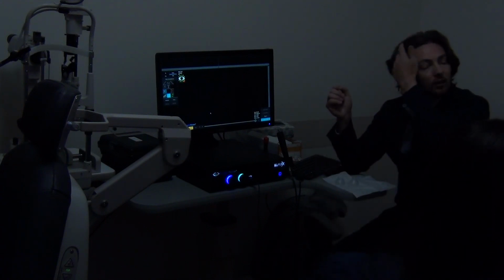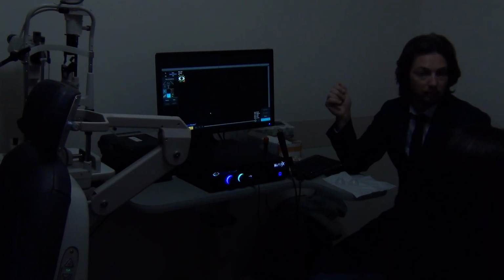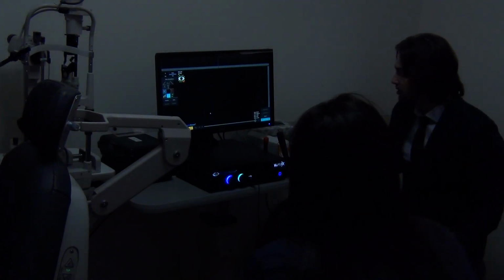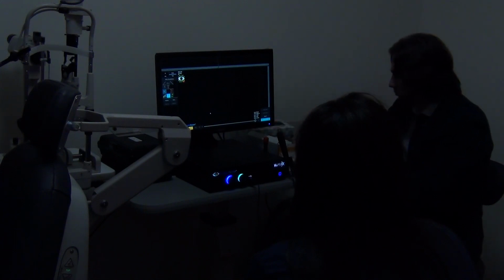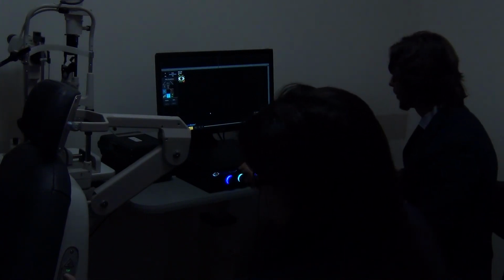We have some distilled water in the room. It's in that kind of squeezable bottle, in the room where the base scan was. Would you grab it? Sure. Thank you. It just will be easier. Okay. So, prepare Tetracaine. Yeah, prepare that now already. All right.